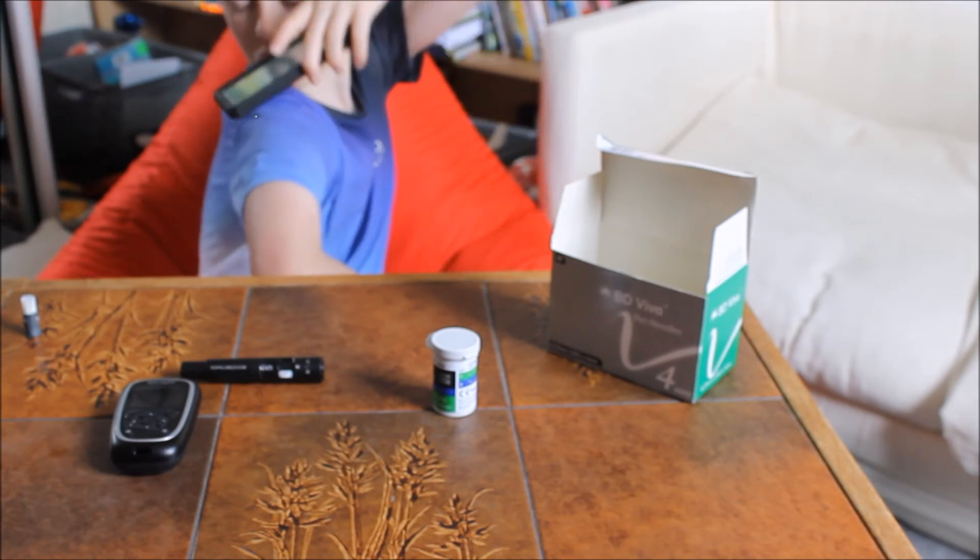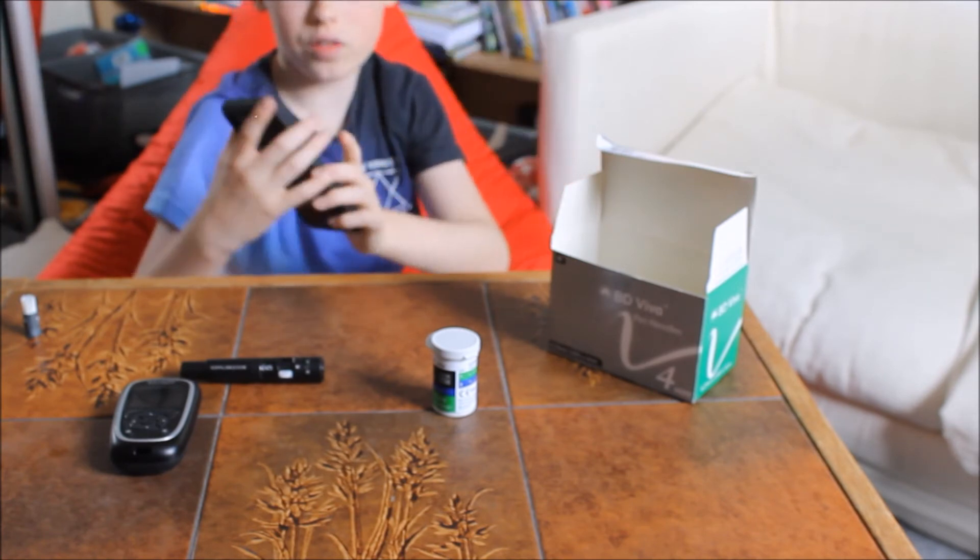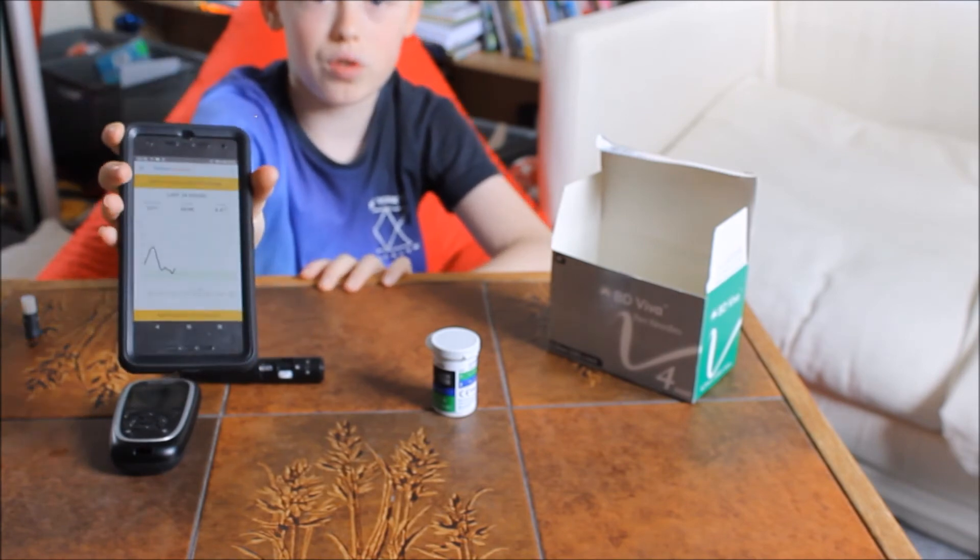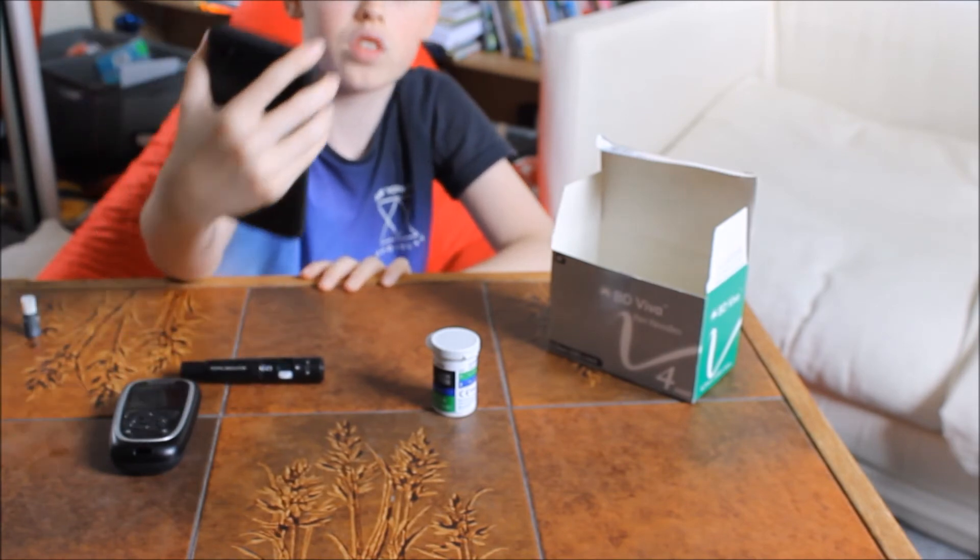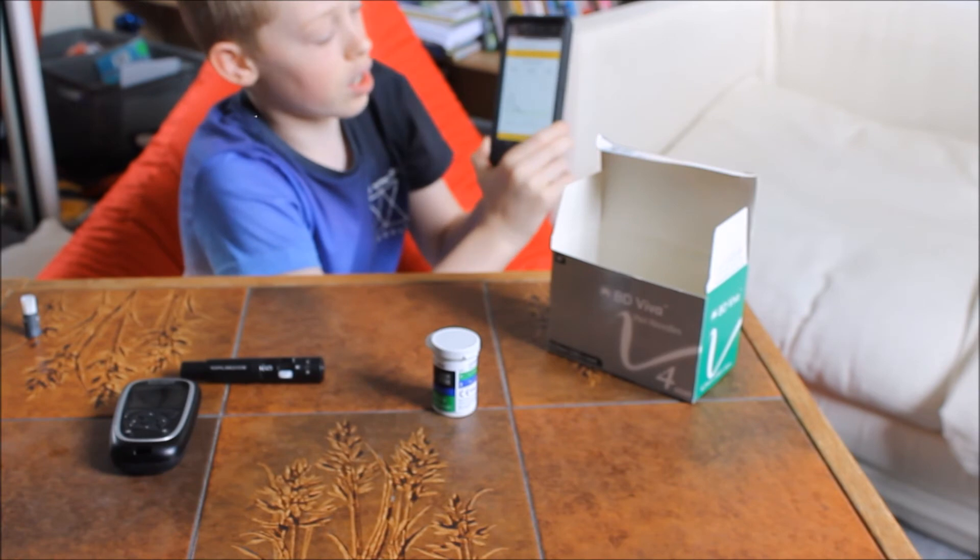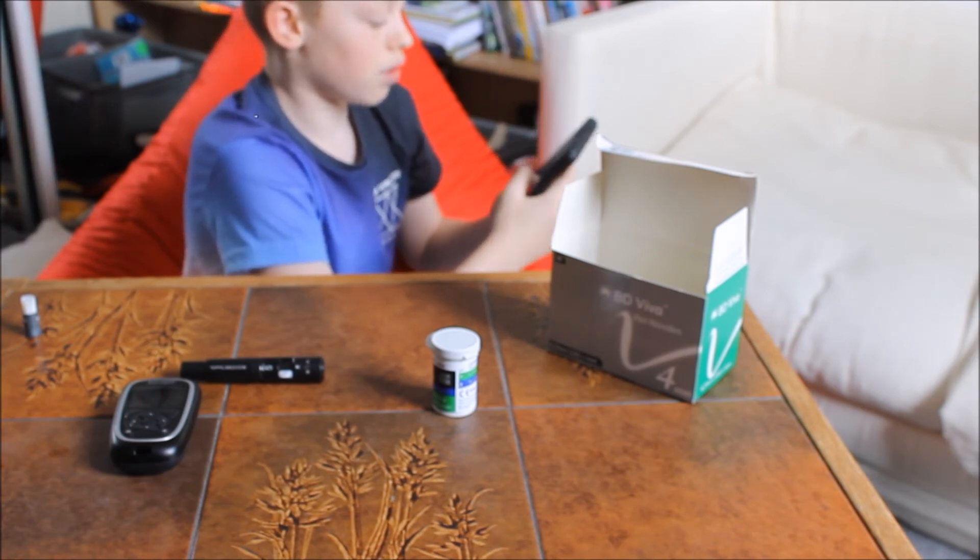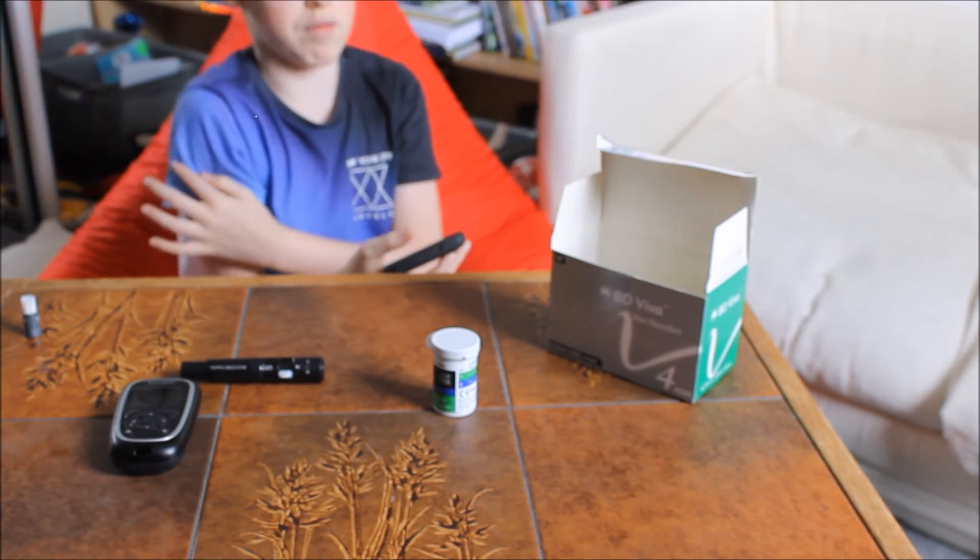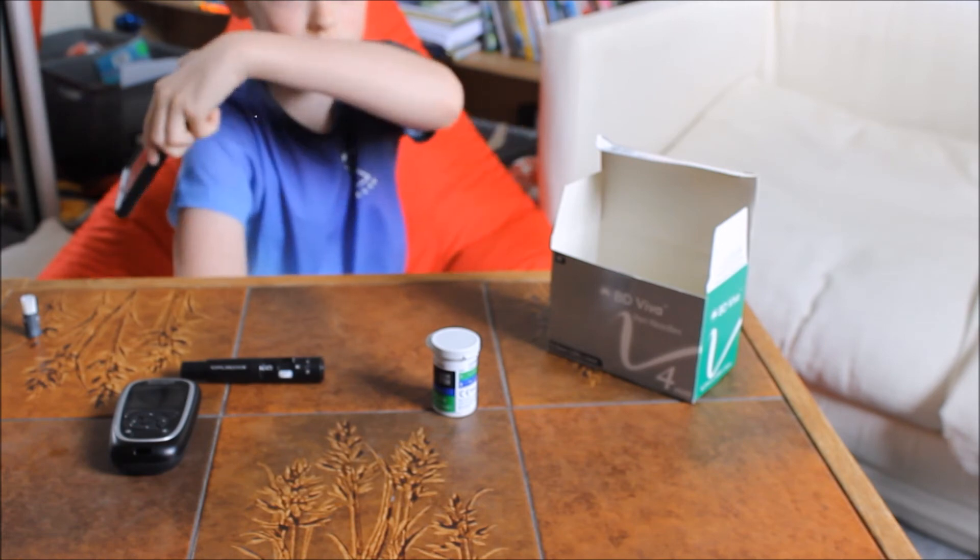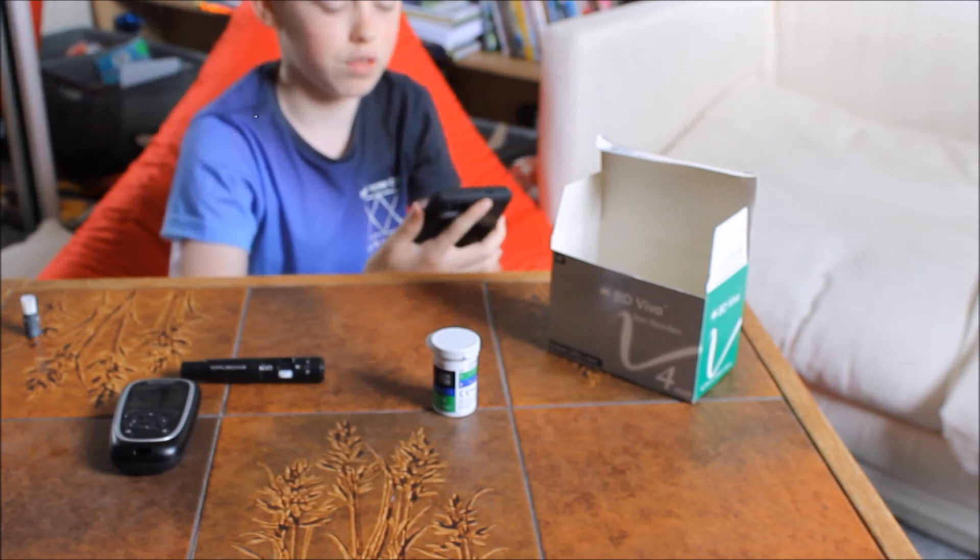Then to do a new sensor, you don't have to press any buttons. You just have to scan the back of your phone on the Libre like that. And now it says Libre can be used in 60 minutes—new sensor starting up. So that's how you use the Libre. In 60 minutes time, if you're going to have a meal, you can just scan and it'll give you your numbers.